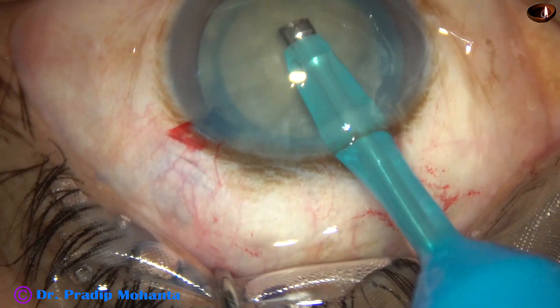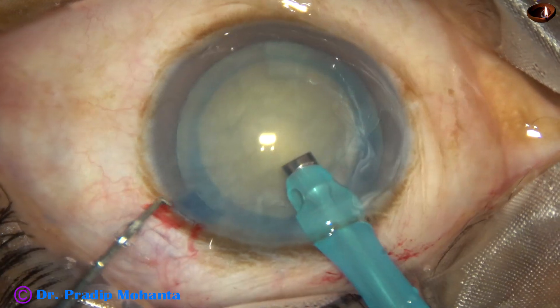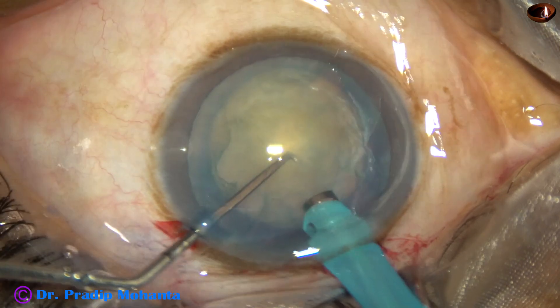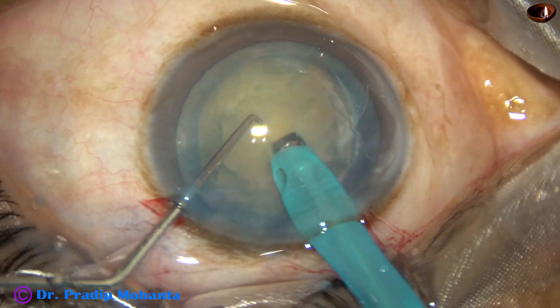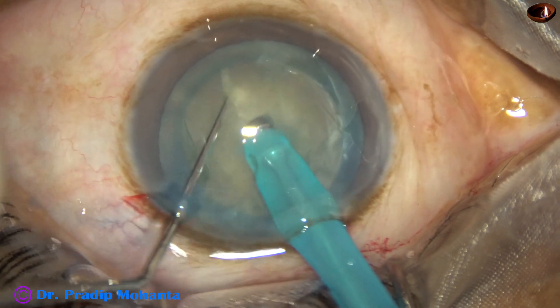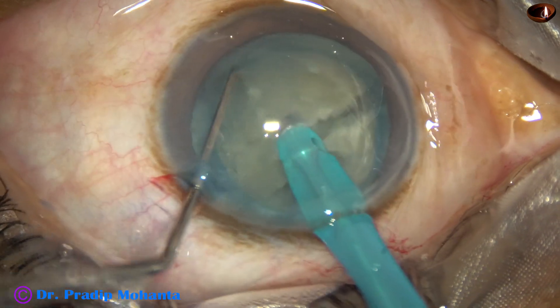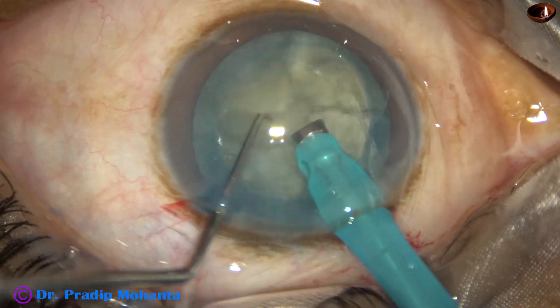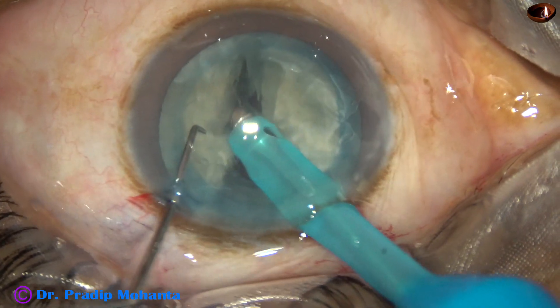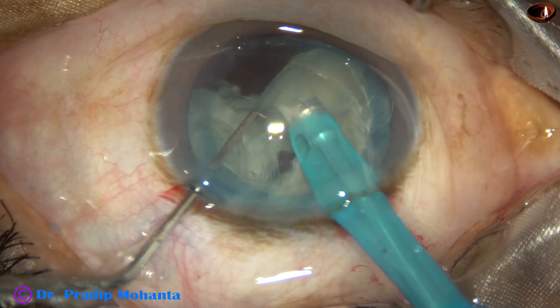I am going to do a direct chop and divide this white nucleus into several fragments. Bury the tip completely into the substance of the nucleus, hold the nucleus very firmly and chop it. And here is another chop. This nucleus is very brittle, there is no leathery fiber and it is getting chopped very easily — four completely separated fragments.